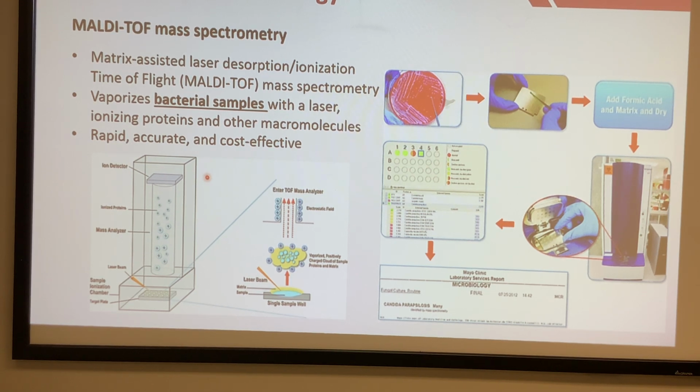And even though I said the machine is quite costly, if you consider the volume the machine can handle, it's actually very cost effective. I think right now at FinTop they are doing $5 each. Only $5 each. But if you're doing biochemical testing for identification, it takes 2 to 3 days and at least near $100 for each identification. So you can see the difference.